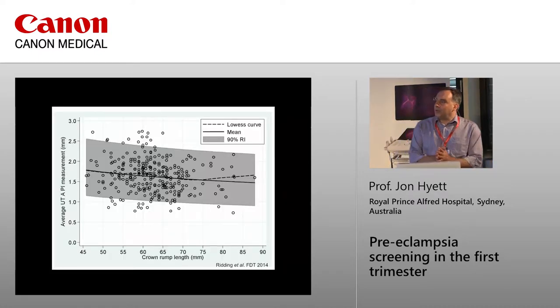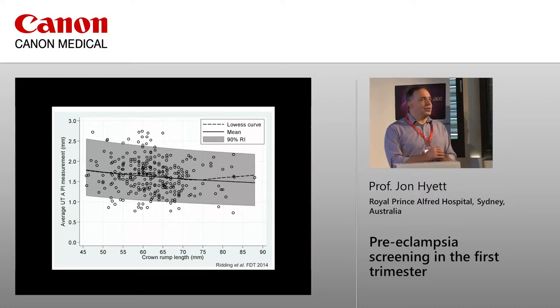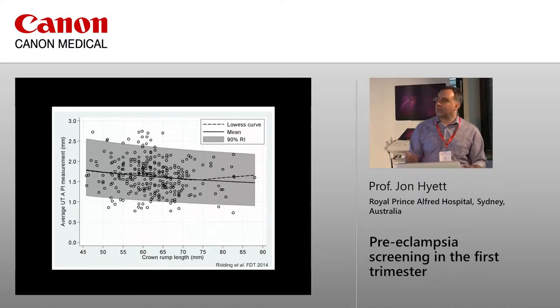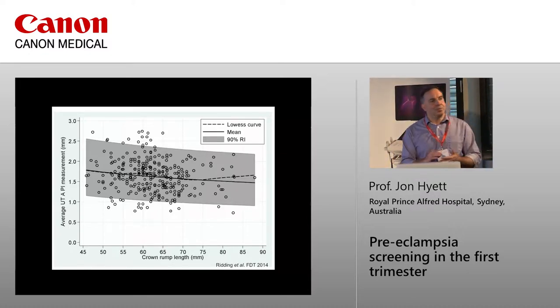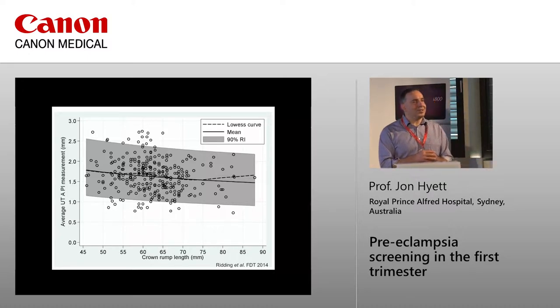So people often ask me, what's the normal range for a uterine artery Doppler in the first trimester? And if you go to the literature, it's actually very difficult to tease that out. So for example, Kypros's group, a guy called Walter Placencia, produced a paper about what uterine artery measurements should be in the first trimester, but it's a customized measurement. So it relies on ethnicity, your parity, whether you smoke or not, what your BMI is. And if you asked Walter what's a normal value, he'd say, well, you've got to tell me those four things before I can tell you what the normal range should be for that patient.